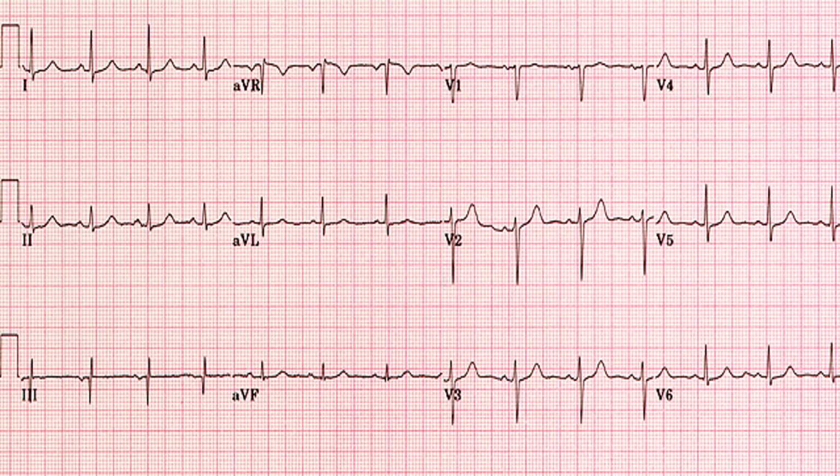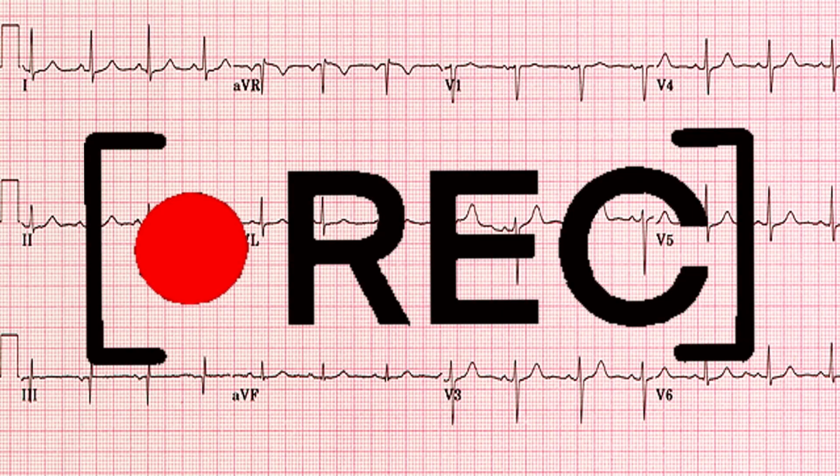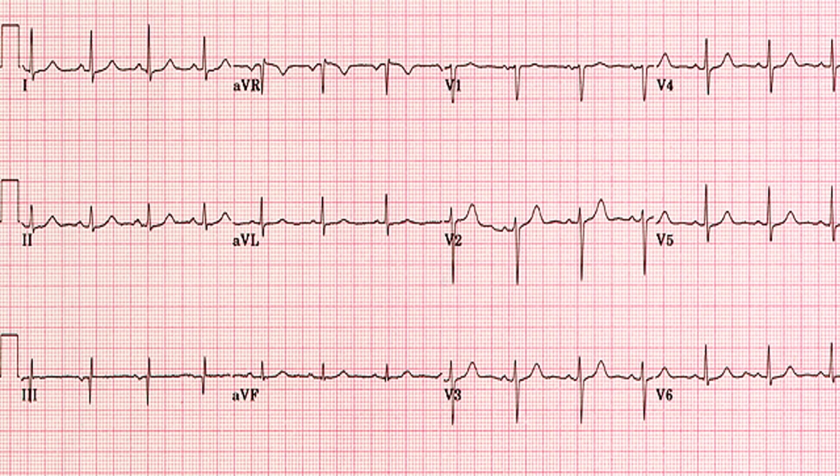So what is an electrocardiogram? Electro meaning electrical activity, cardio meaning heart, gram meaning recording. So electrocardiogram means recording of electrical activity of the heart.